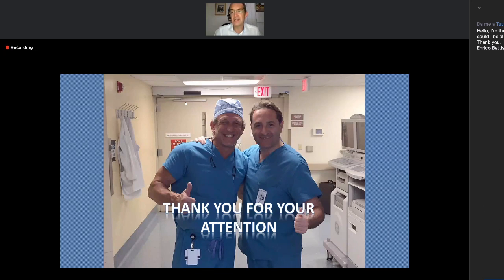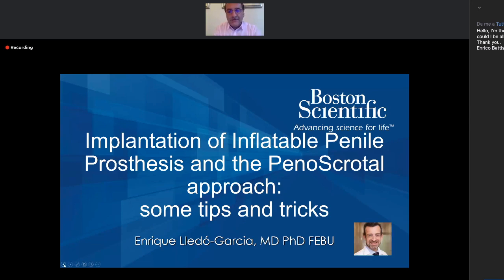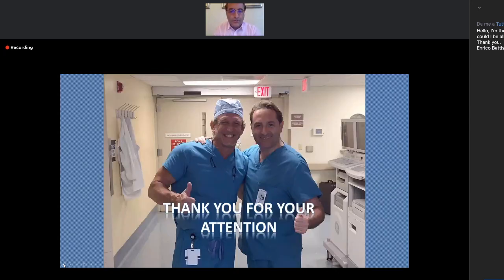Can I ask? And Gabriella first, thank you. Yes, at the moment I'm always using the infrapubic approach for the first implant and for the revision. It's very easy to remove the prosthesis and implant the new prosthesis. I'm using the penoscrotal approach with the malleable because I saw that it is better, because you can have the incision larger, like Saleh told before, about 3 or sometimes 4 centimeters. But I always use the infrapubic approach for the first implant and for the revision of the hydraulic penile prosthesis.